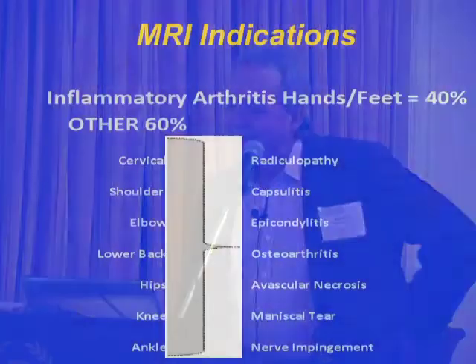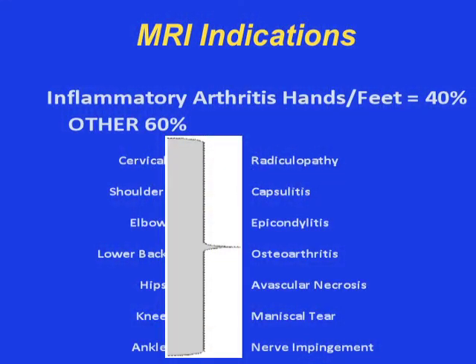And so let's just look at the indications in your practice that you could basically find for you to do an MRI. And listed there is essentially from head to toe the different diagnostic categories that would at some point in time probably need, not benefit, but need an MRI to determine the state of their disease.